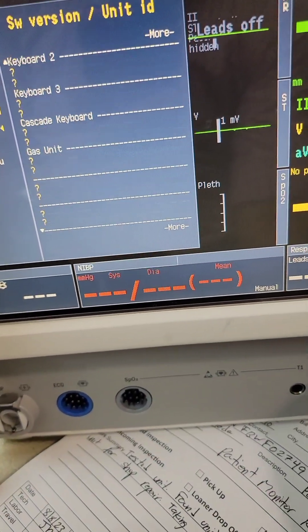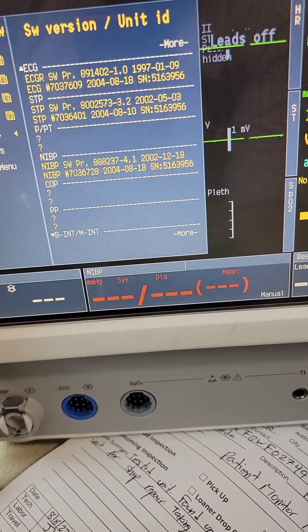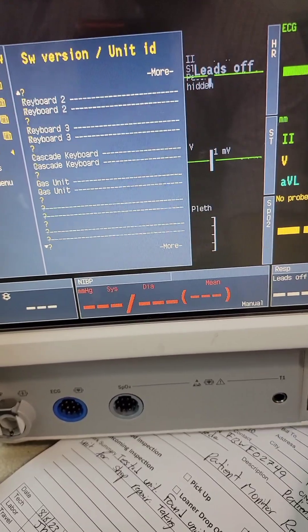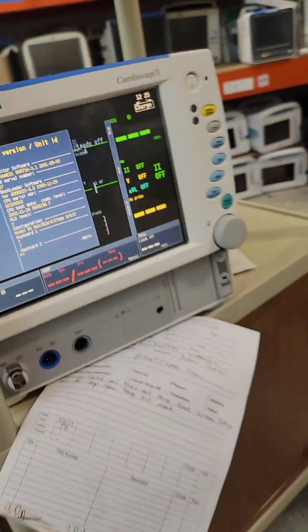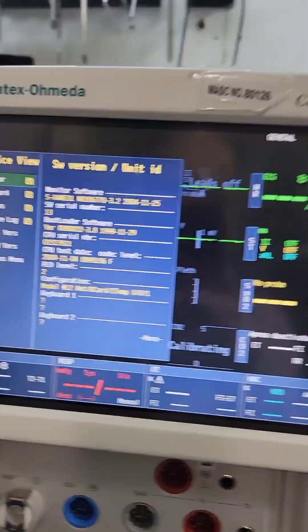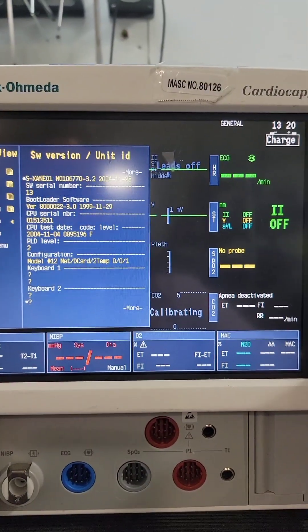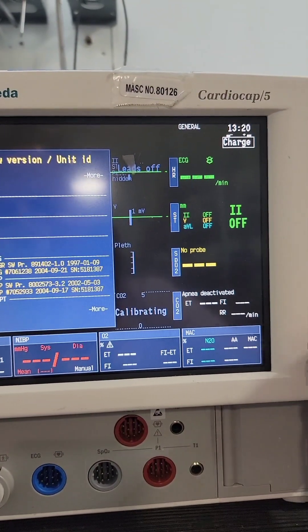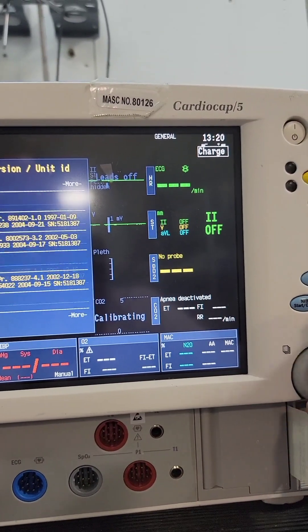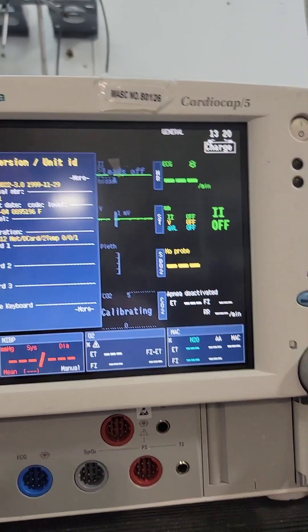Gas unit — this one doesn't have a gas unit. If it did, it would tell you. So ECG, NIBP, nothing else. If it had a gas option, you would see a different monitor. This one's not seeing a gas unit.